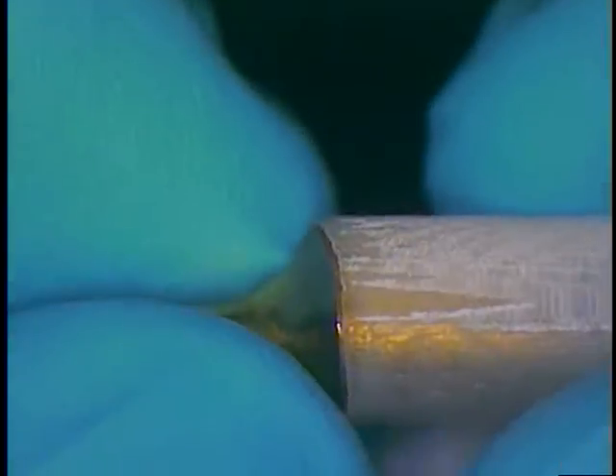Now we're going to unscrew this and just recheck the threads. Threads look good. Put that analog away. This goes in the jig for the transfer first. Put that in place — that seats all the way. Then undo the other analog. Re-seat this, pushing it all the way down. Now they're both ready to go. We also made sure that we had plenty of room for our driver — that's important. I'm rechecking that. I just want to make sure the driver's bottomed out completely, which it is.